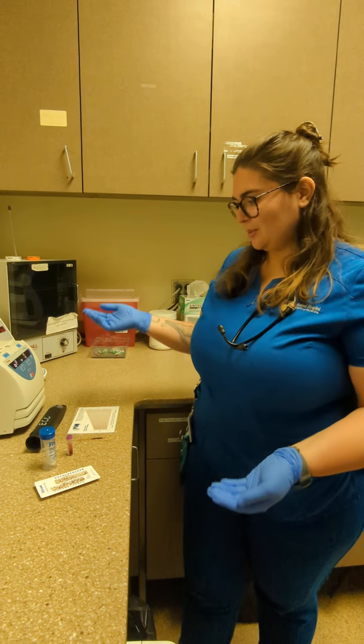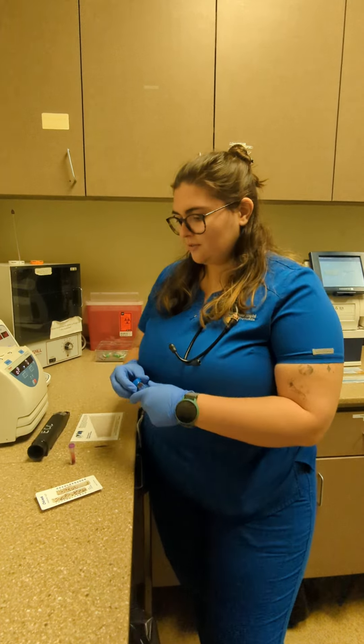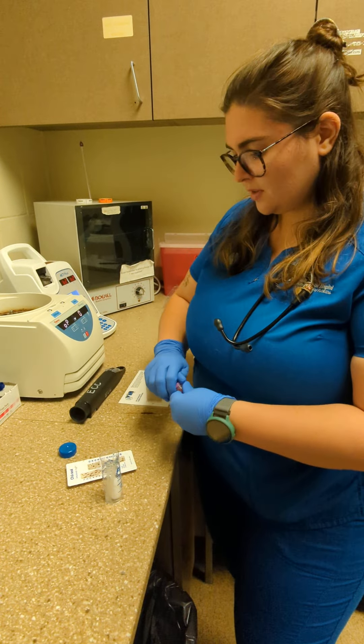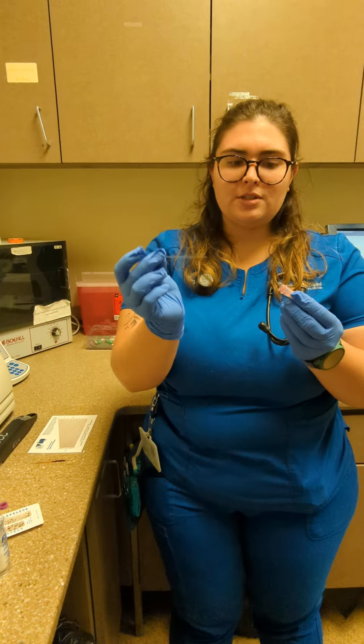Today is August 22nd, 2022 and we will be doing PCV total solids. To fill them, you'll invert your sample and take a capillary tube, then leave it horizontal.